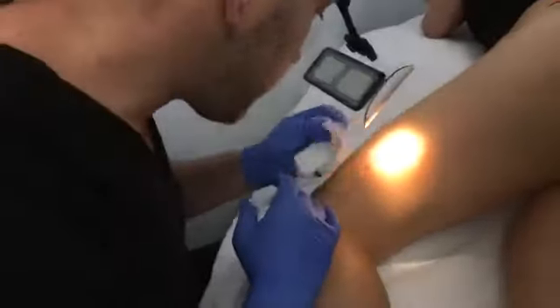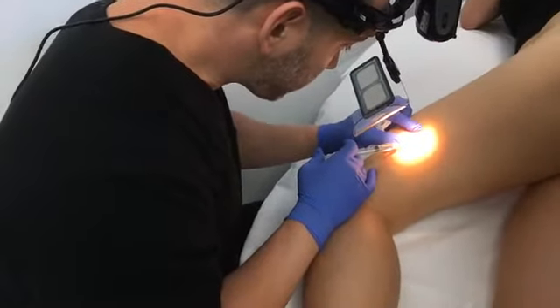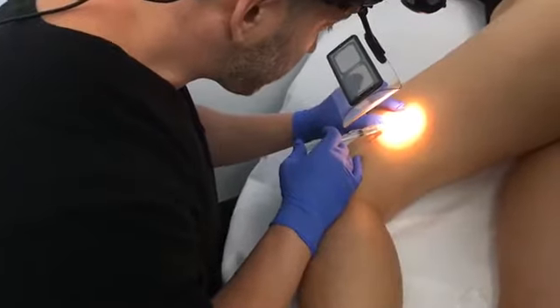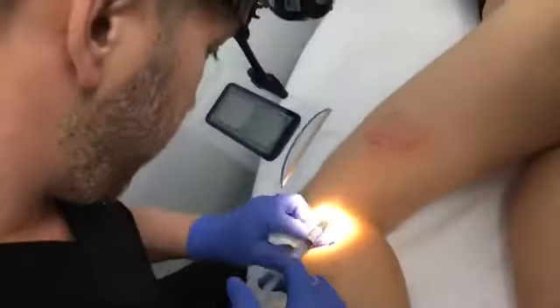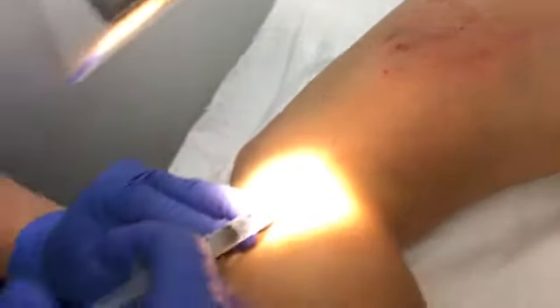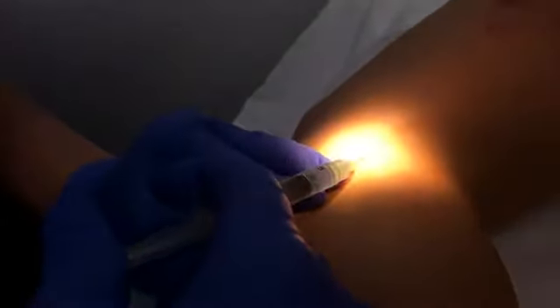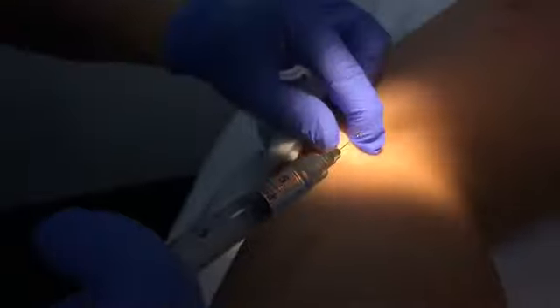Okay, so that's a good example of a large patch. Now we can go to a reticular vein, which is these deep blue veins, and you can see it spreading from here. So we're going to go into that deeper blue vein and just inject. You see it lighten up immediately. This one will burn a little more. And spread it directly into the vein.